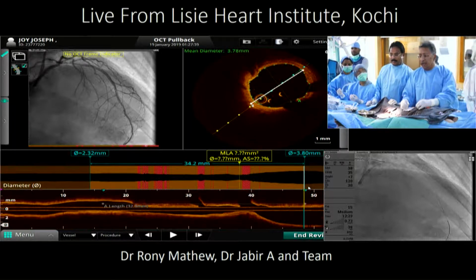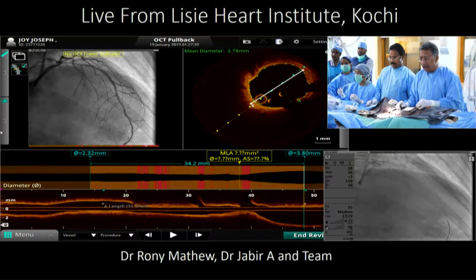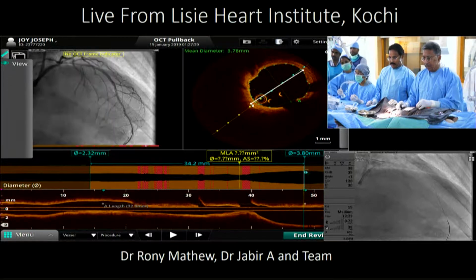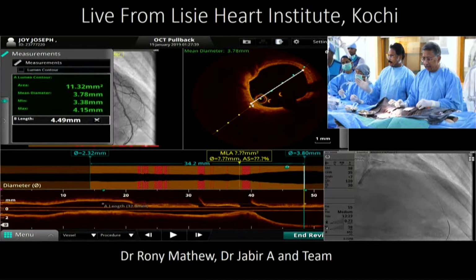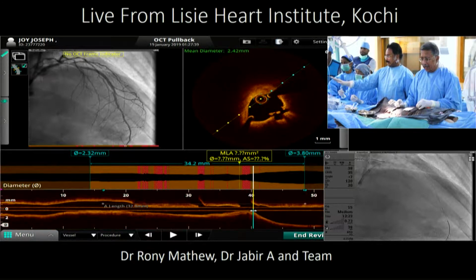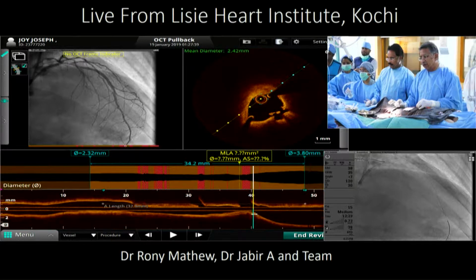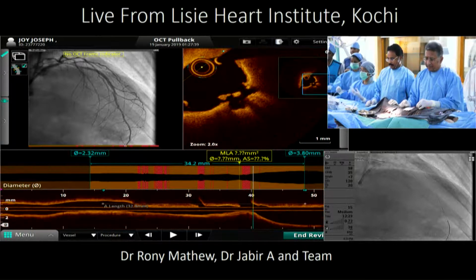Right. I do agree with you, Dr. Nicholas. Dr. Musna, can you just take it on to that distal left main? What about calcification? That's what I want to show you. So just go on to the distal left main, and something that we surprisingly saw there, at the distal left main, you see a ruptured plaque at the 3 o'clock to 4 o'clock position. Just take that and zoom in here. Yes, with a little thrombus there, which we were a little surprised to find.